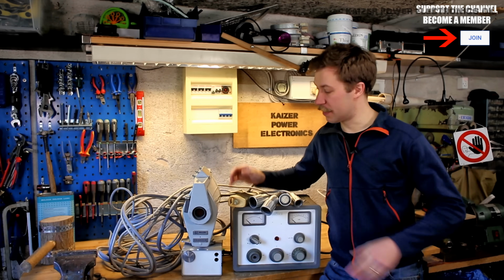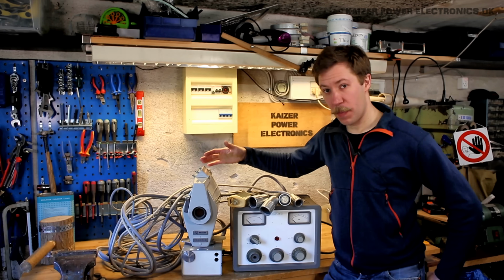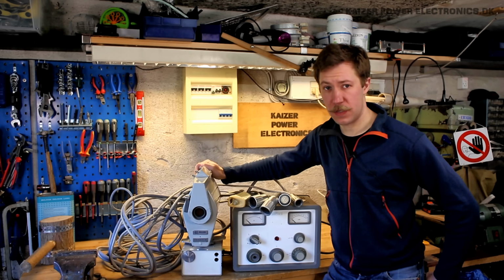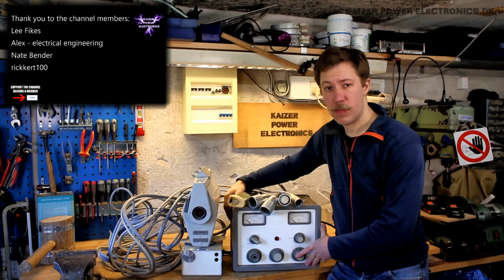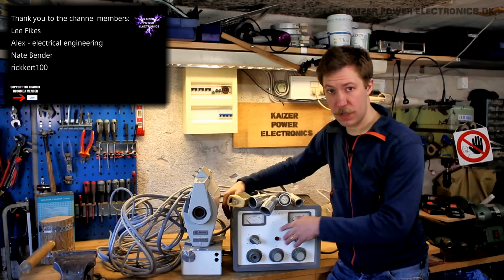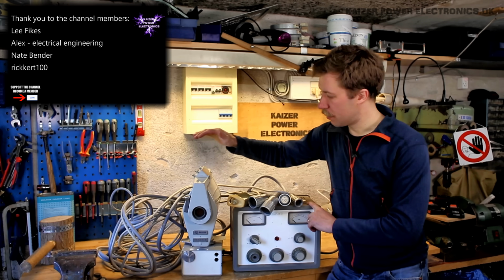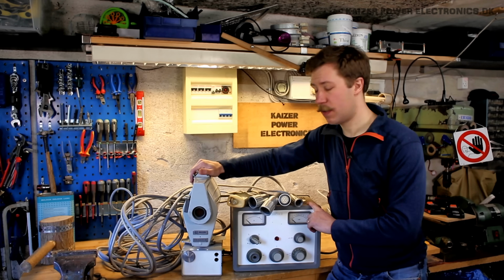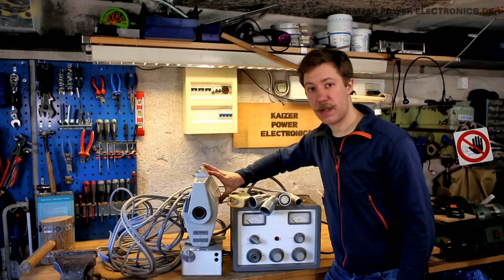Today we're taking a look at this Philips Practix X-ray system. It is a rather mobile system, except for of course the weight. It consists of a main power unit here, where you can adjust the milliamps, kilovolts, timer, etc. And that feeds an inverter which outputs power to the high voltage transformer located inside the head here, where we also have the X-ray tube.